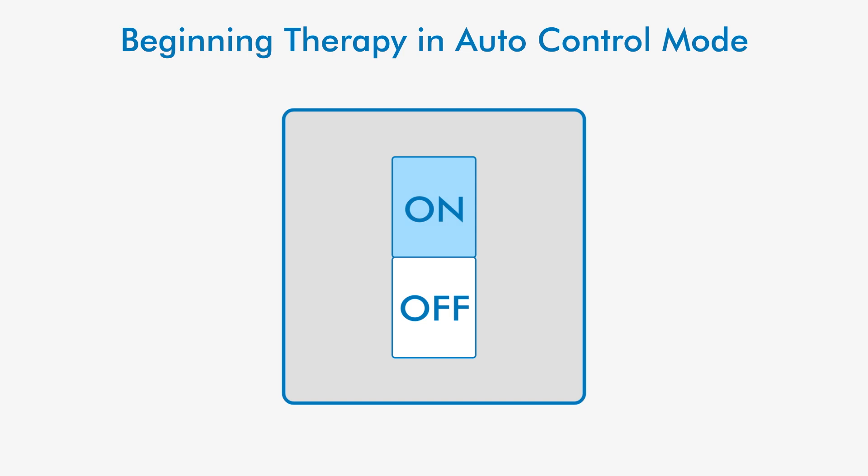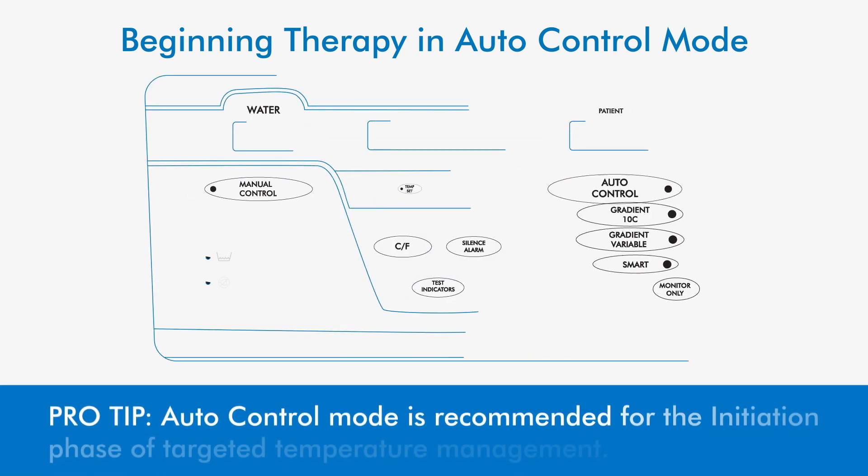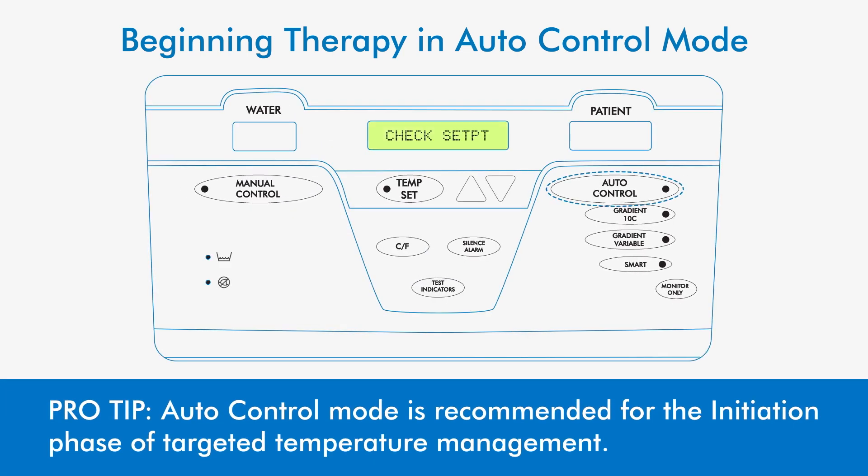Press the power switch to the on position and choose auto control mode. The STX console will monitor the patient's temperature and regulate water temperature to get the patient to the selected target temperature.